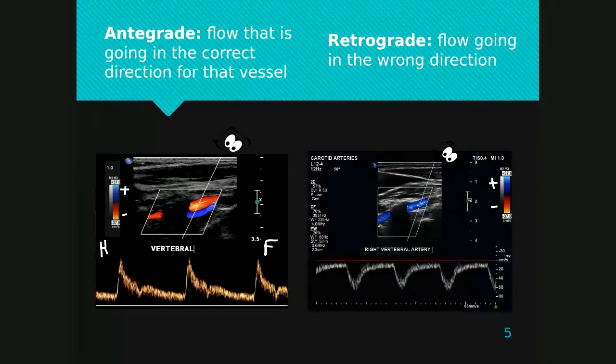And in this picture, we have the vertebral artery along with the vertebral vein. And we always have a little area of shadowing because it courses through the cervical vertebrae. And there's going to be a bone in this section, which is going to attenuate the sound. So we usually get little pieces of the vessels. So if you knew your anatomy, you'd know this is the artery, okay?